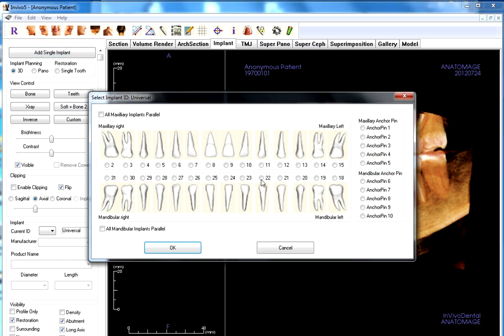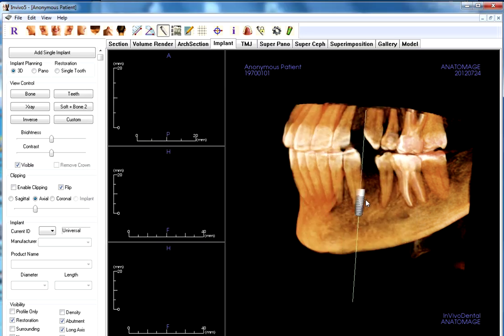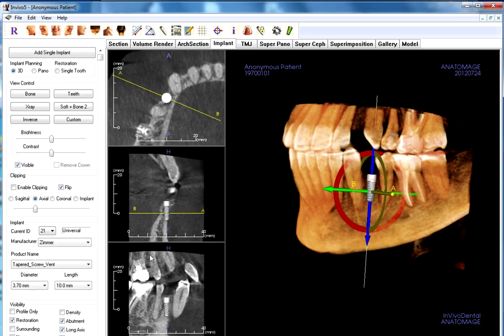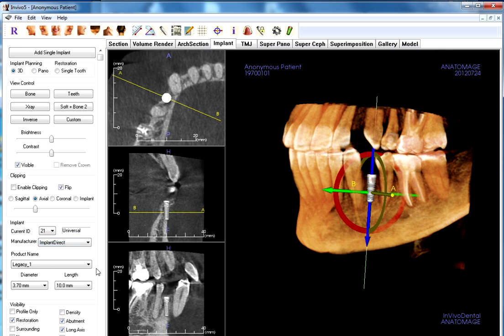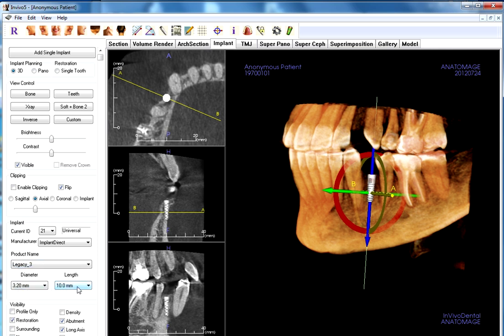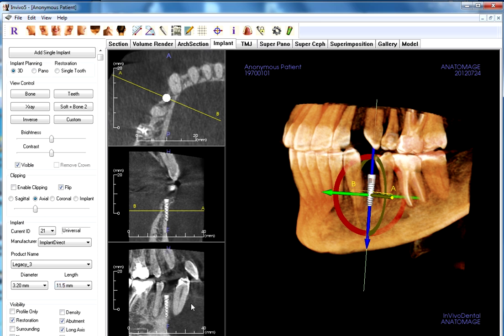We're going to add an implant to site number 21 and just drag and drop that into place. Our default setting is Zimmer, but I need a more narrow implant, so let's go with the Implant Direct Legacy 3, 3.2 millimeter, and I'll make it 11.5 long.